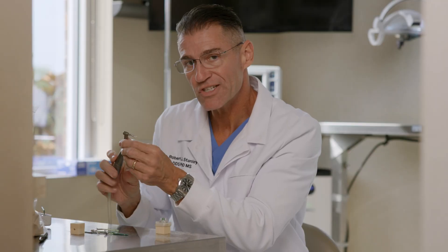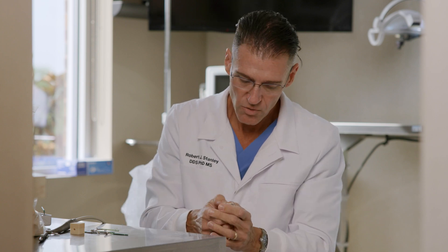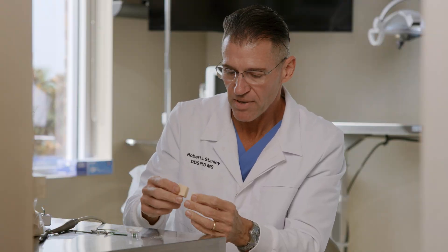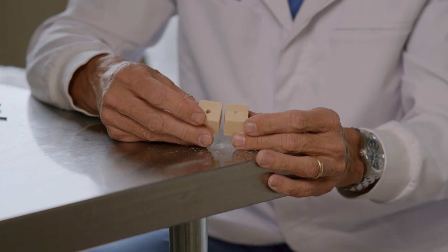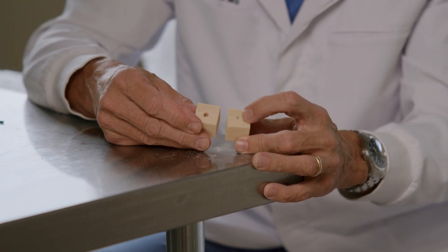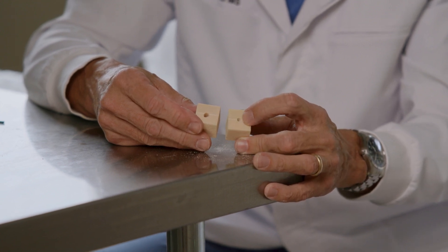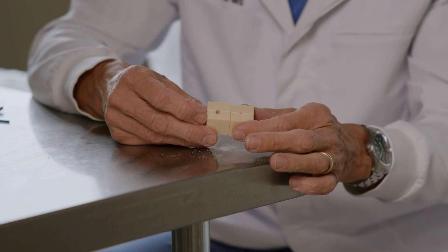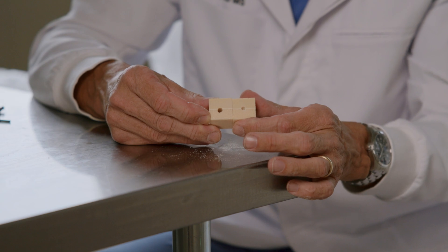Now the question is, how well did we do? We pull the surgical guide off and we are right in the center of the glue line. When we compare that to the unguided block, you can see a substantial difference in the size of the hole as well as the location. That's because the unguided drills were wallering around, not being constrained, hitting the hard bone and bouncing off — making a hole that's not the right size and not in the right location.